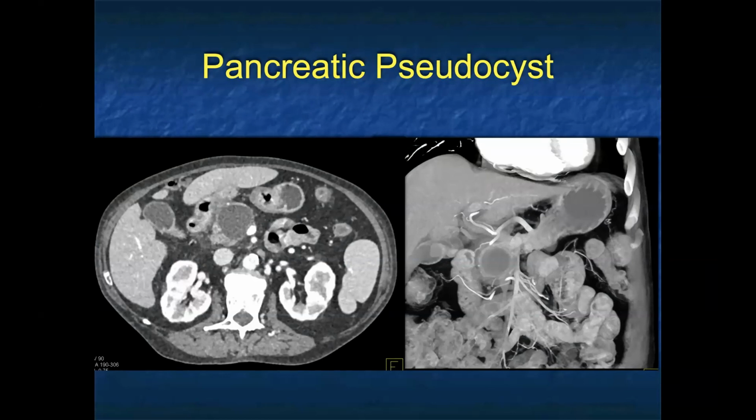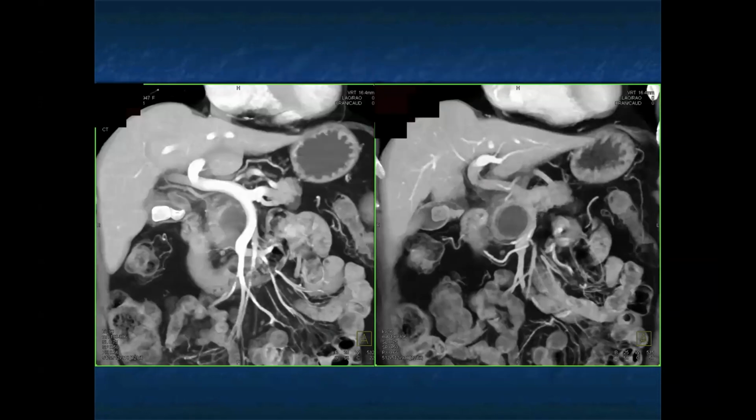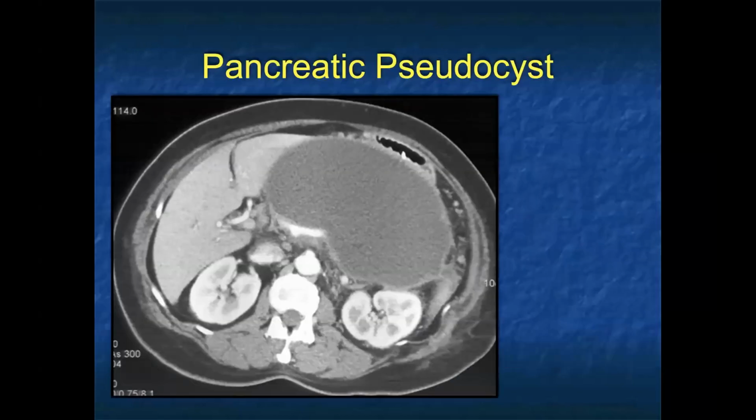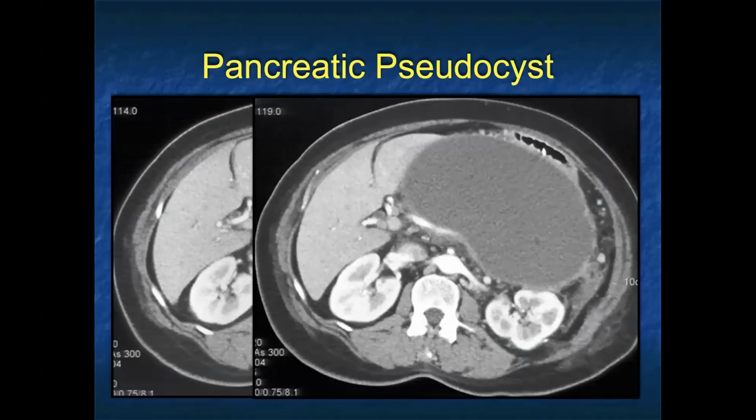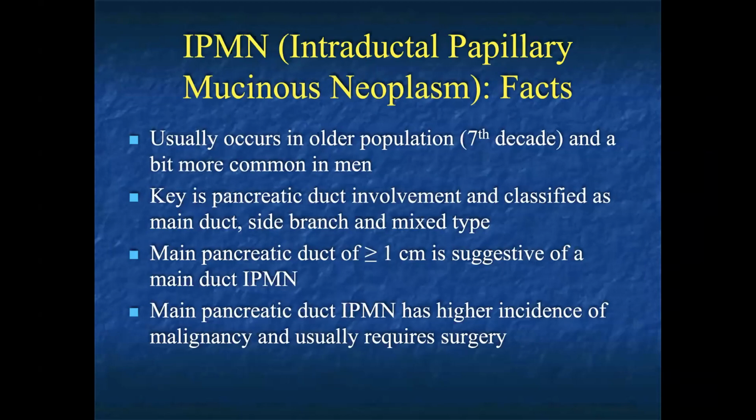Occasionally, you'll have pseudocysts, obviously in patients with no history of pancreatitis, and those can be a bit challenging. If this patient presented to you and there was no history of pancreatitis, you're obviously thinking about IPMNs. So there can be a great overlap between the 2 processes. And here's just that lesion again, pushing against the patient's portal vein. Pancreatic pseudocysts, often you'll see changes in the gland, dilated pancreatic duct, edema in the gland, and classic locations like lesser sac indeed make that diagnosis easy to do.